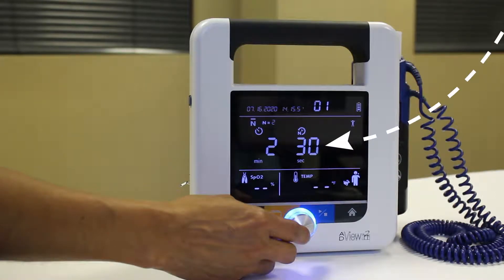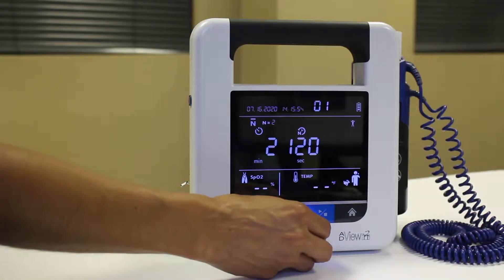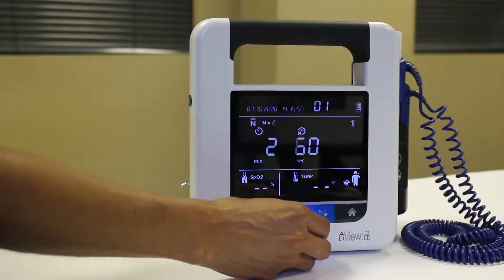Last, the time between measurements icon will flash. To keep the current setting, press the knob. To change the setting, turn the knob to choose the desired interval and then press. You can choose an interval between 15 and 120 seconds.